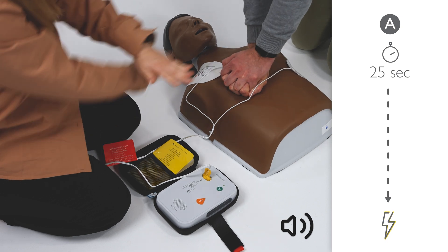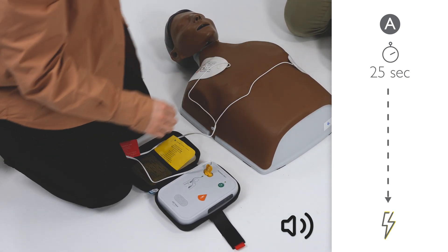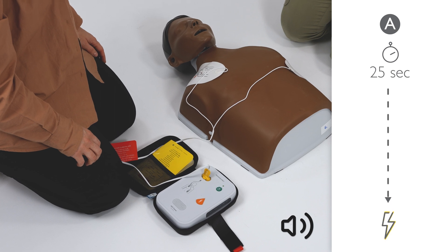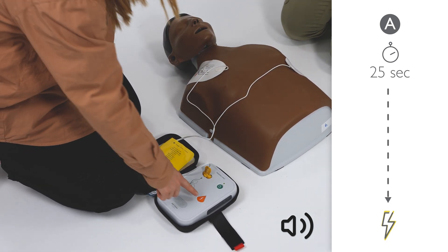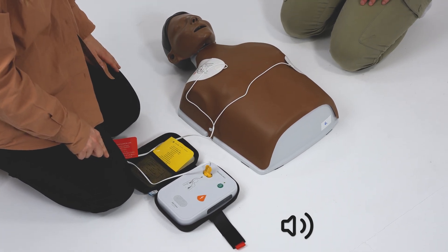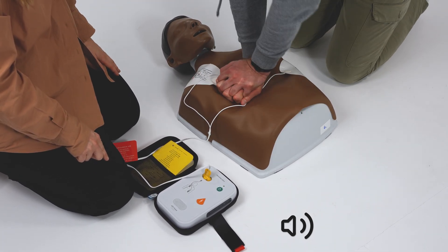Stay clear of the patient. Analyzing heart rhythm. Shock advised. Shock delivered. Begin CPR. It is safe to touch the patient.